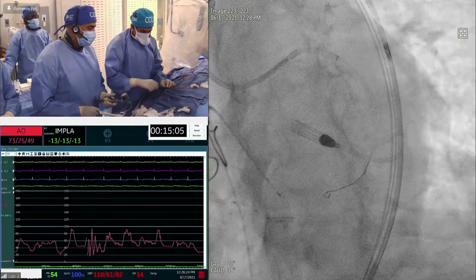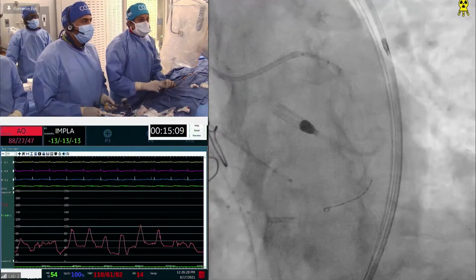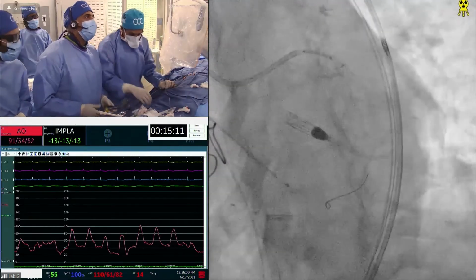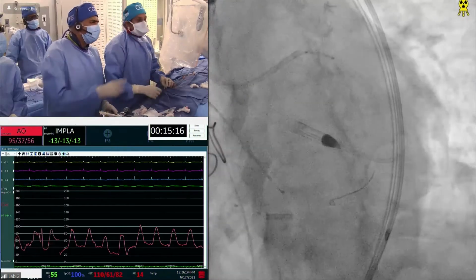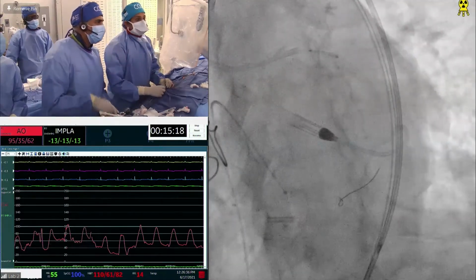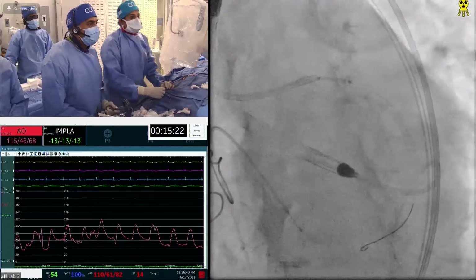Again, need the Guidezilla. You see that? Yeah, exactly. It's short, amazing. Forgive me, short? Do you guys worry when the stent is there, you bring in a Guidezilla? Aren't you more worried that you could accordion the stent sometimes, right? It's 10 millimeters.